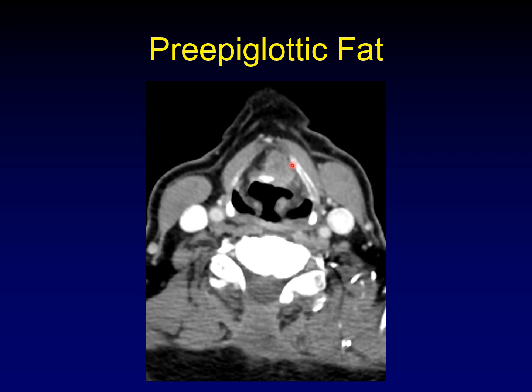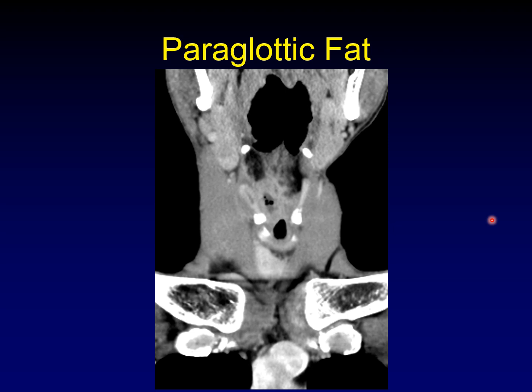Here's that same example with invasion of the preepiglottic fat, and there probably is some infiltration of the paraglottic fat as well, with relative preservation on the other side. Here's another example of involvement of the paraglottic fat — you can use the symmetry of the larynx to see the preserved paraglottic fat on the normal side in this coronal image, while a necrotic tumor is infiltrating the inferior component of the paraglottic fat on the affected side.